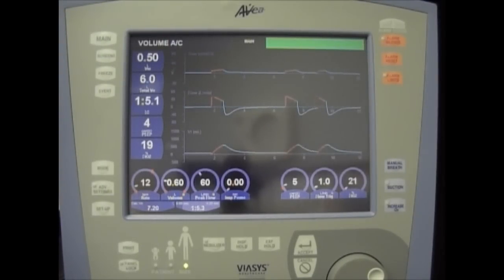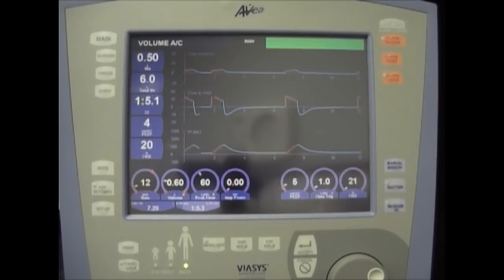My ventilator settings are SIMV of 12, tidal volume of 600, and PEEP 5.